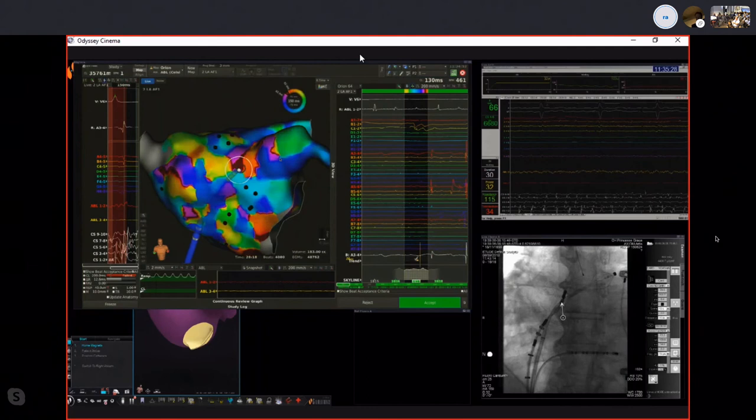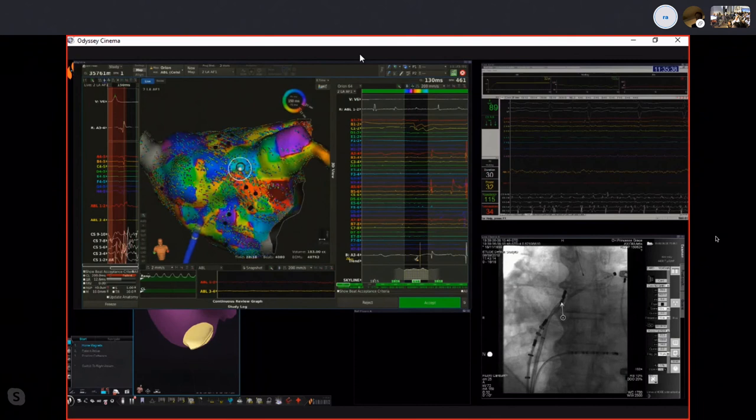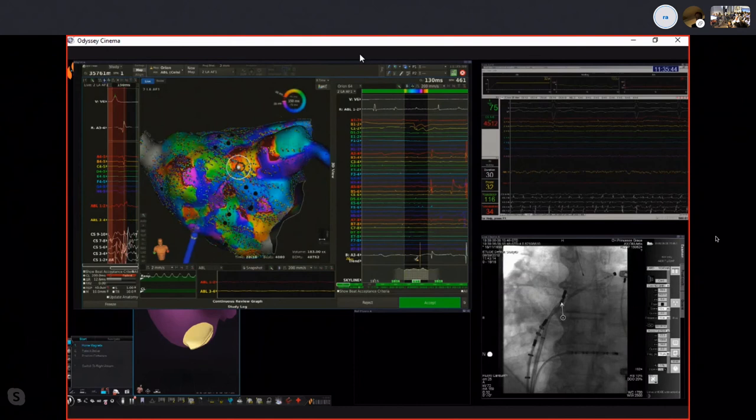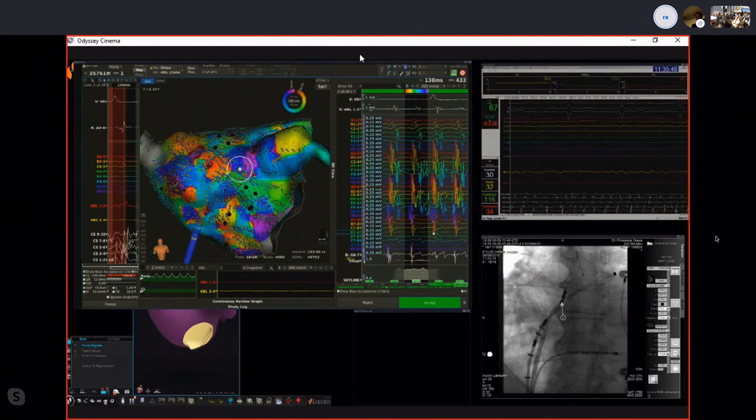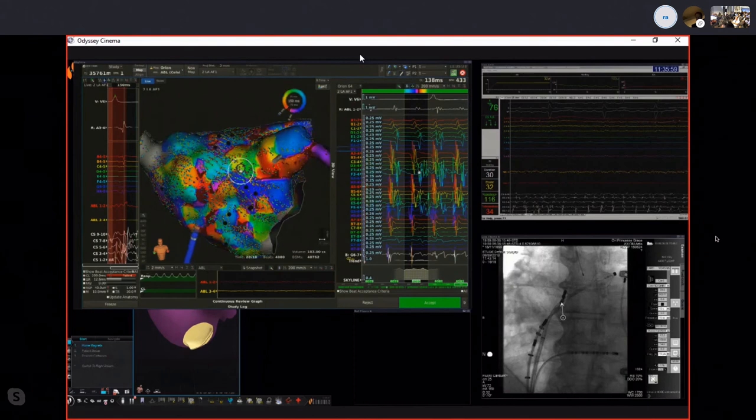So let's check that this is not an over-interpretation of the map. I'm just going to be sure that in this area we have enough electrograms in order to be reliable and not just having a reconstruction. So I hope you all agree. And now let's take a look at these electrograms. And you can see here all the electrograms that were acquired with the Orion catheter during several consecutive beats. And I hope that you can also appreciate how consistent between successive beats this activation pattern is.